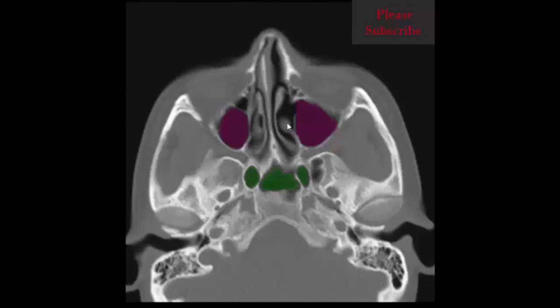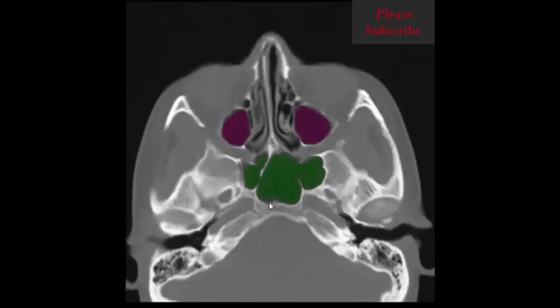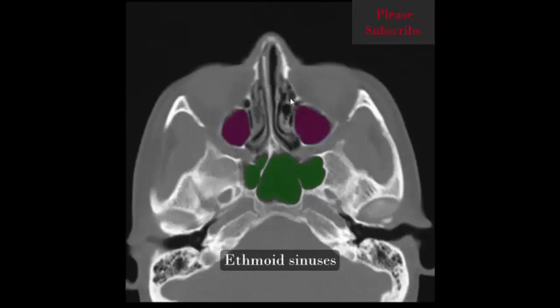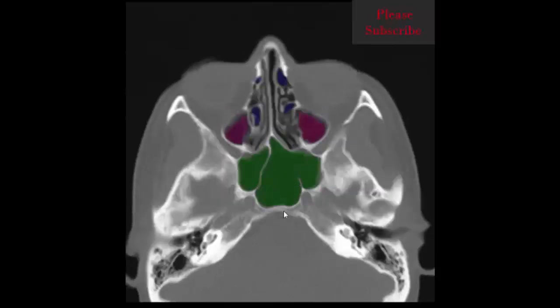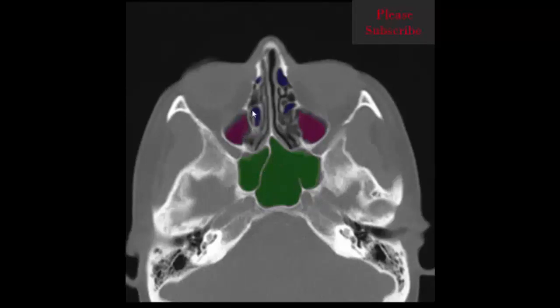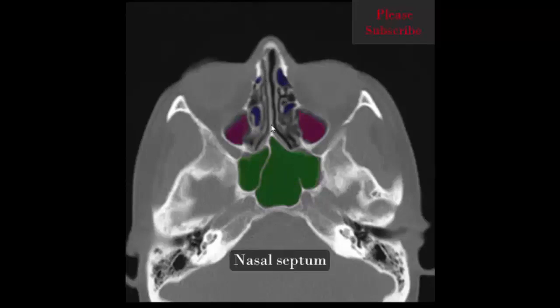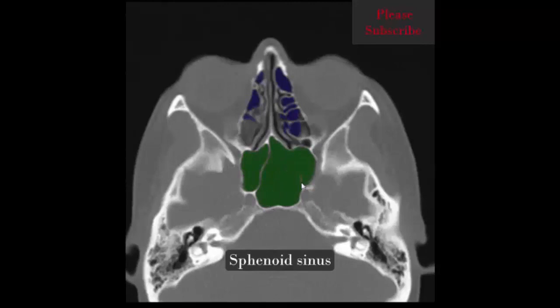At higher slices we can now see the superior turbinate and sphenoid sinus. Also visible are the right and left maxillary sinus, ethmoid sinus, sphenoid sinus, nasal septum, and nasal cavity.